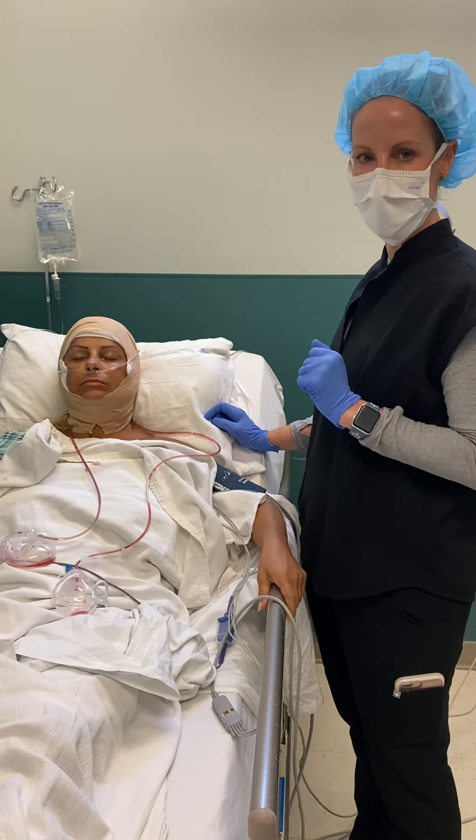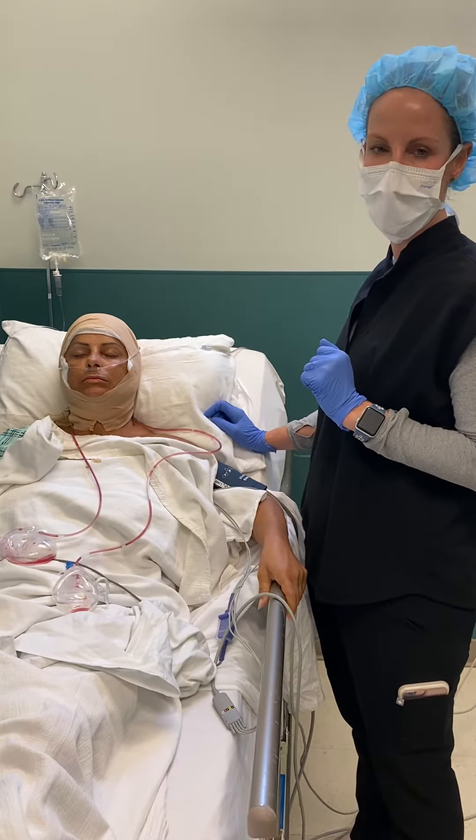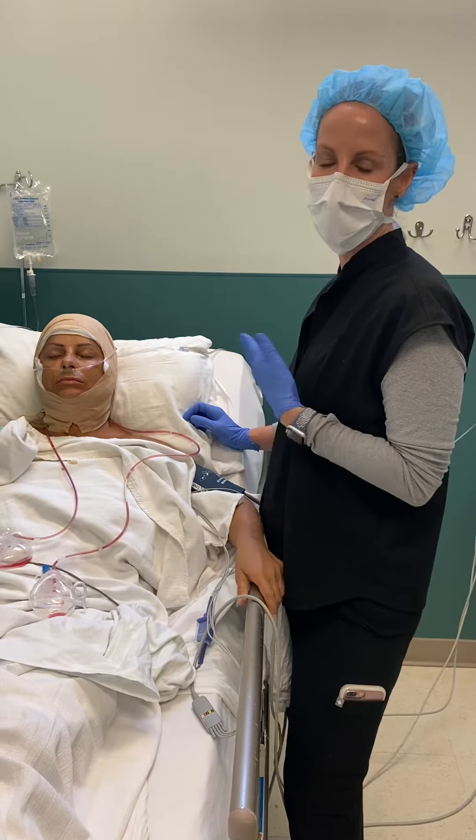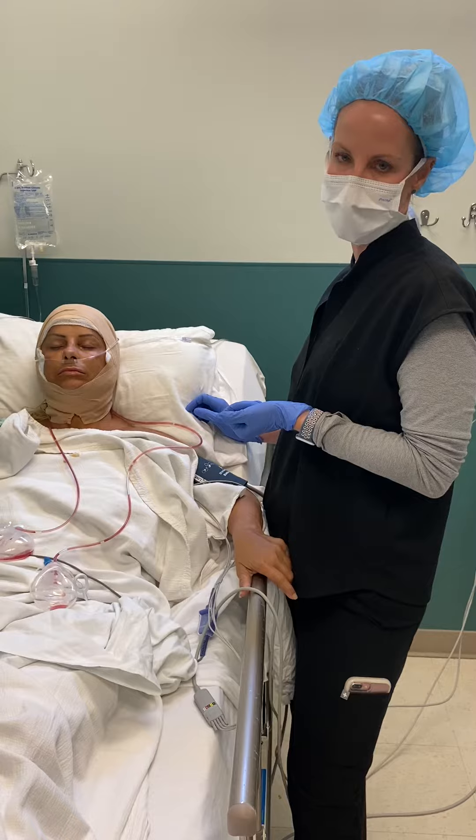Hi everybody, I'm Vanessa. I'm the OR Director here at the Surgical Suites for Dr. Weniger, and I just want to go ahead and demonstrate how to do the drain care.